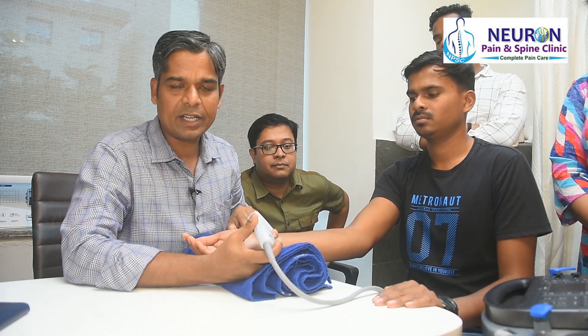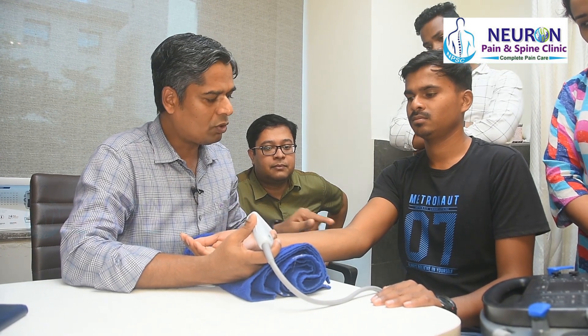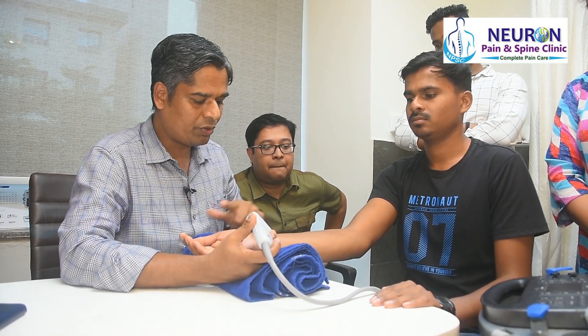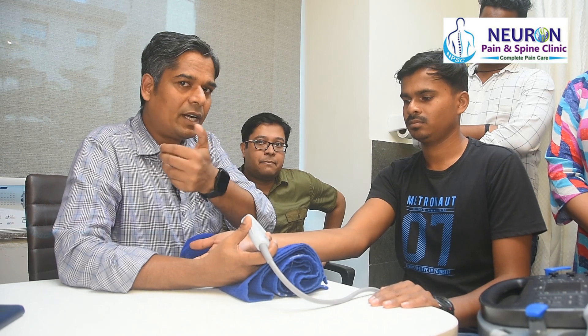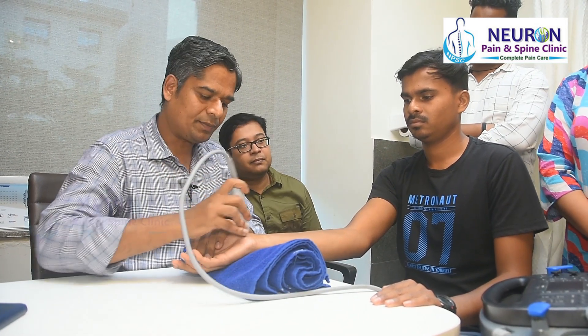I'll start scanning at the wrist and then slowly go all the way up to the elbow — from elbow to wrist — because for those who are novice, in the beginning they may find it a little difficult to identify the median nerve in the wrist. So let us start here.